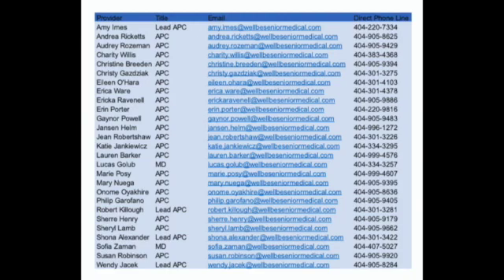If this occurs, please explain that the orders from our medical direction are that every ECG must be reviewed by a Wellbe physician immediately. In most cases, this will be the on-call physician for the month. The other possibility is that based upon your assessment findings, you feel an ECG is necessary to rule out a possible dangerous condition. If this occurs, inform the APC of your findings and ask if they agree. If so, get the name of the physician that will review.